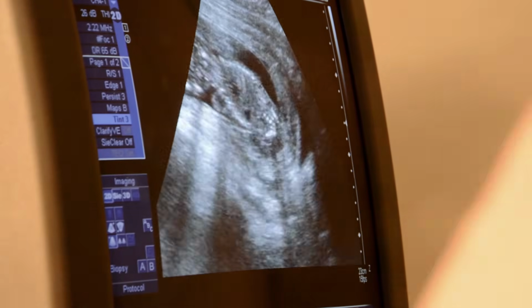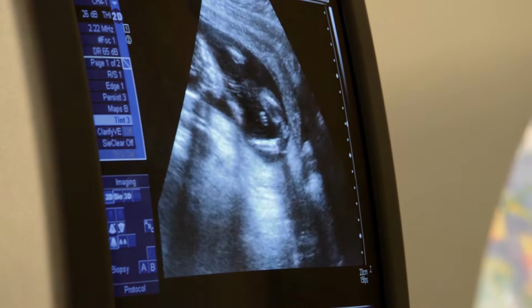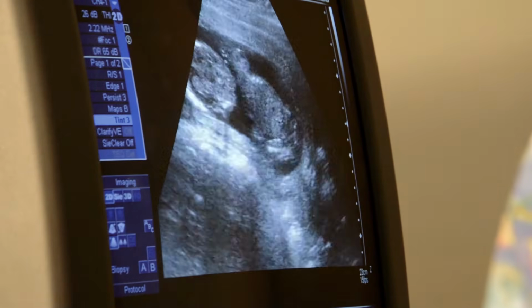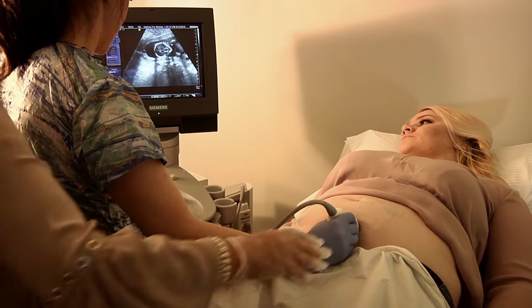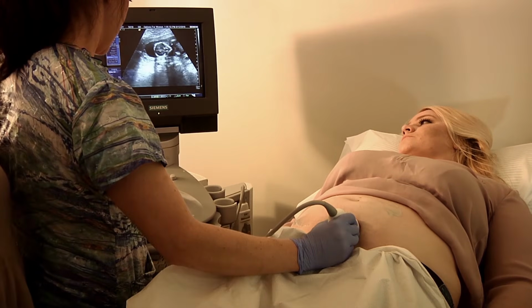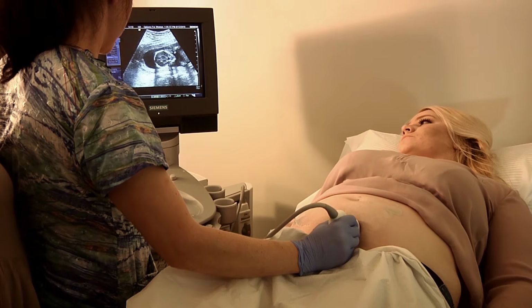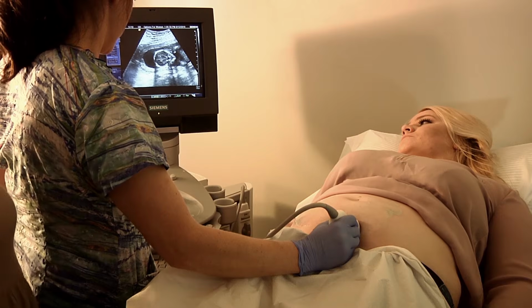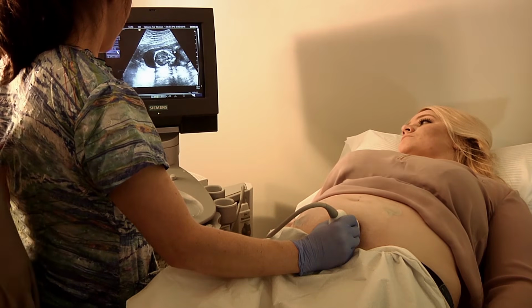And so now what do you need to get? I need to get the other side. The fundus. So you just move straight up there until you get to the fundus. And then I would adjust your depth again. And I would bring that down. And then freeze that. And this would be sag midline upper.